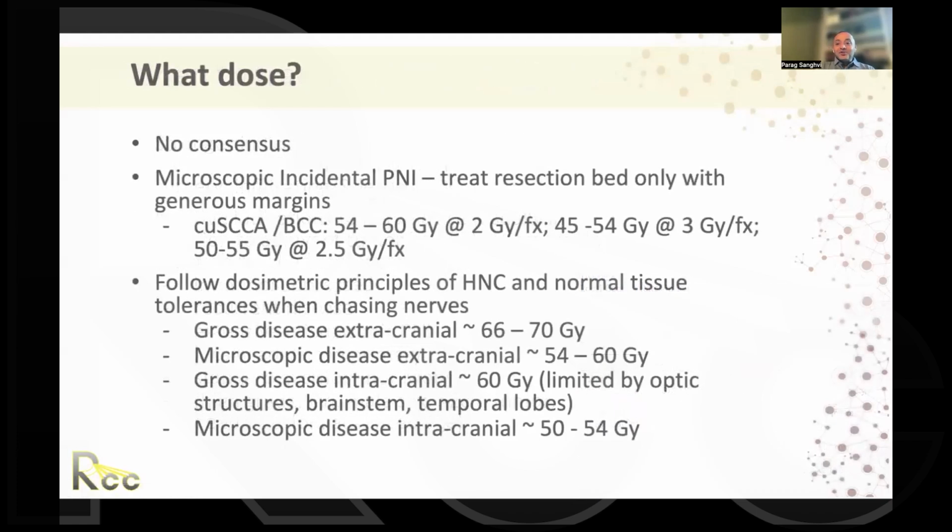What dose? There's really no consensus. I think this is where the principles of head and neck cancer radiation come into play. If I'm just going to treat the resection bed for somebody with either microscopic or incidental PNI, I'm going to follow the very standard skin cancer doses that I use. The first thing I look at is, where is this skin cancer? How big an area am I going to treat? How cosmetically sensitive is this area? Based on that, I decide whether I'm going to do a 6-week course, a 4-week course, or a 3-week course, and then I pick the fractionation based on that.